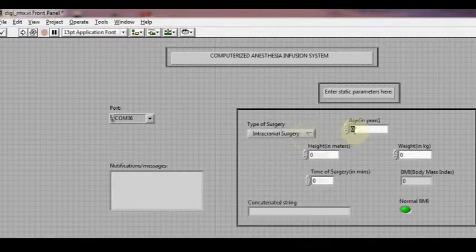The rest of the parameters include the age, the height, and the weight. The time of surgery is then entered.